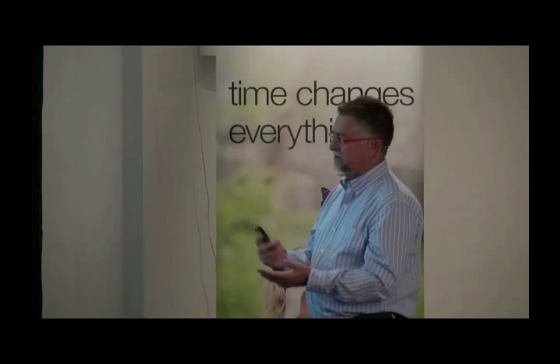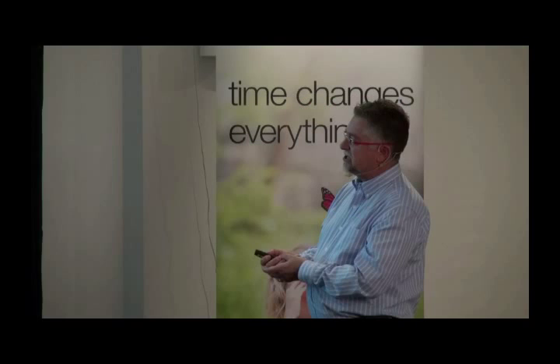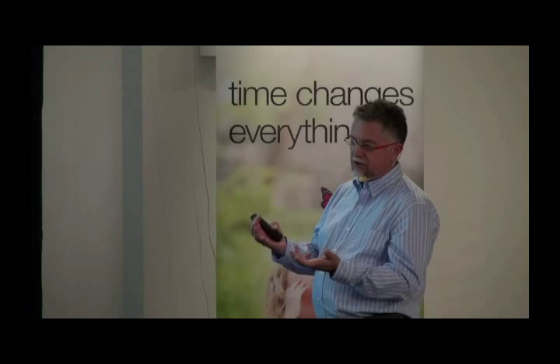What they do is there is an electrolyte solution, and the cells float in there. This area here is magnified to your right, and there are a negative and a positive electrode. As the cells go through, they generate an electrical current. The bigger the cell, the higher the current. Basically that current or resistance is proportional to the volume of the cell.